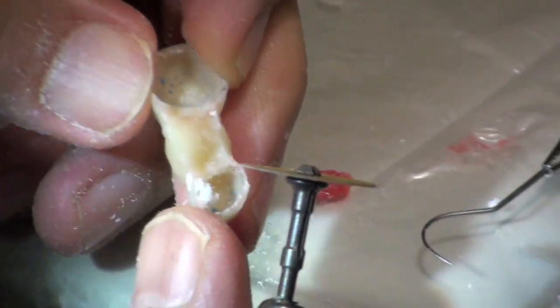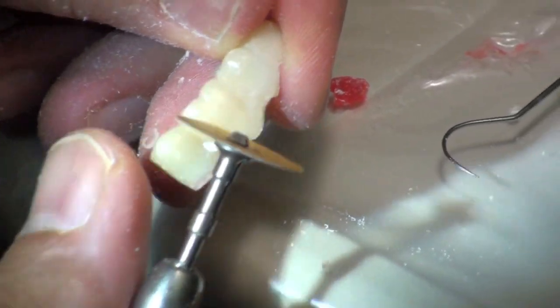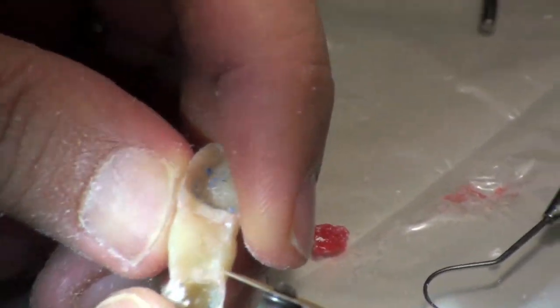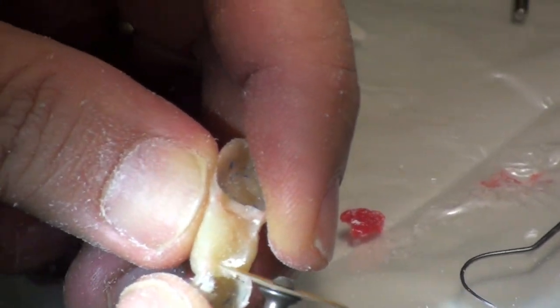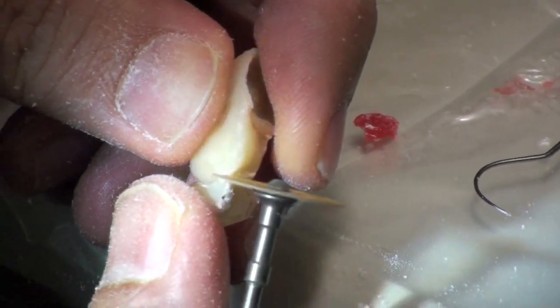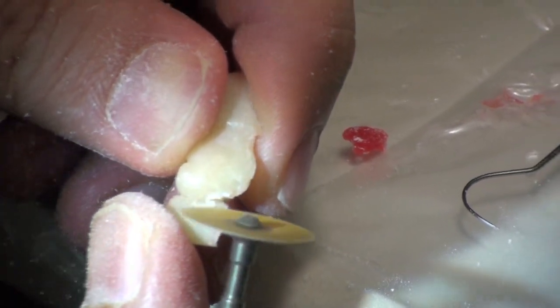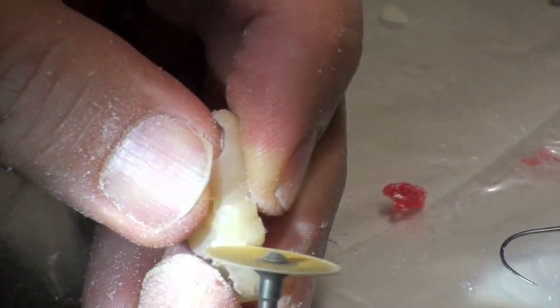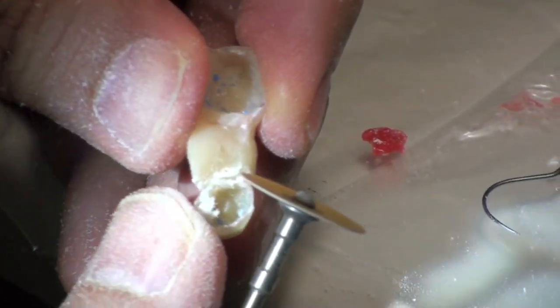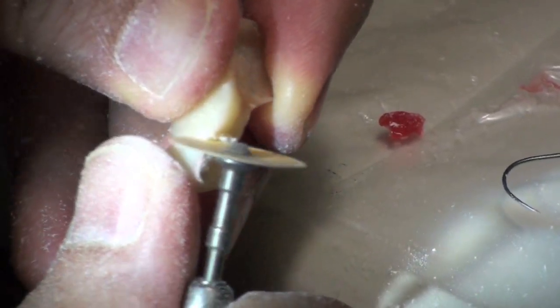So I've got the outside margins more or less okay, but these interior parts are big and bulky and are going to inflame the gums. So we have to open this up. No bridge looks like this — this is a big block. They look like individual teeth. Now, you've got to work by pulling this; don't push it. Pull it to where you want to go, and it will cut in a straight-ahead direction. As I'm doing it, I'm looking where the disc comes out — I'm starting to cut into my pontic, so I want to change my angle a bit. Then I just drag it and smooth. On the inside, same thing: kind of round off that corner. I'm also looking inside at where those margins are. As I get close to it, I like the sandpaper disc.